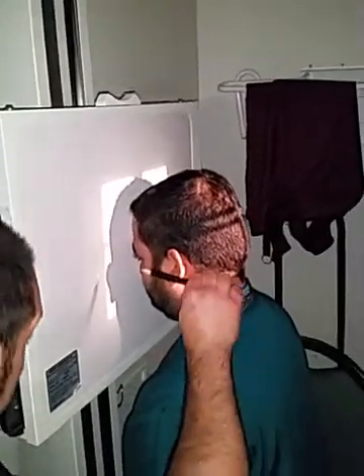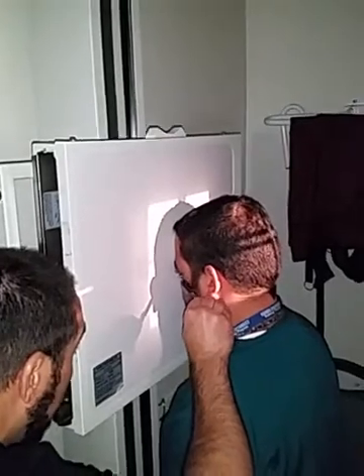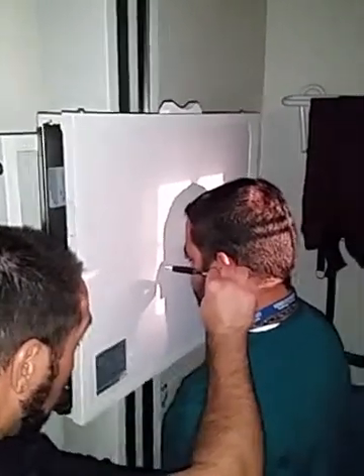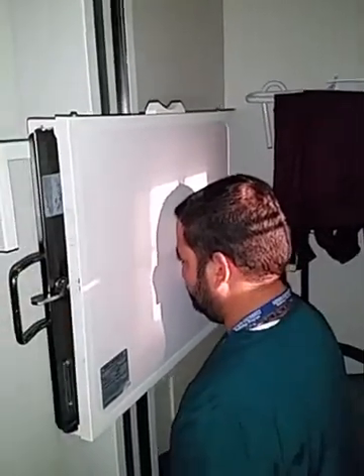Now, I want to see if this OML is lined up, so I'm going to go right here, from the corner of his eye back to his ear. He's one of those magical people where his nose and forehead really does line up his OML.